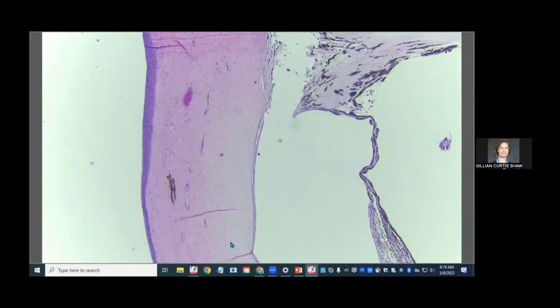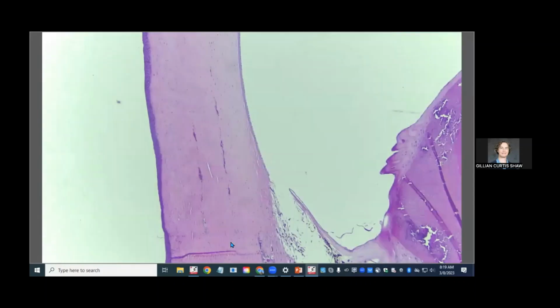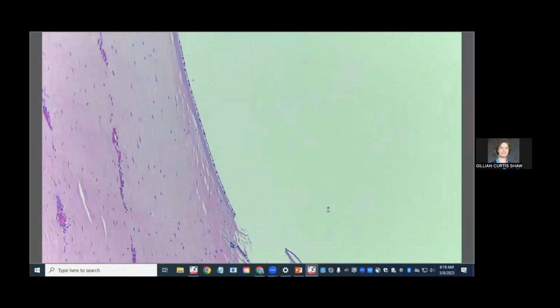And so, we have an axial defect in Descemet's membrane. Which is important because that is one of the key features of Peters anomaly or anterior chamber cleavage syndrome, which in human medicine falls under the umbrella of anterior segment dysgenesis. And then there's a whole bunch of different flavors of anterior segment dysgenesis.